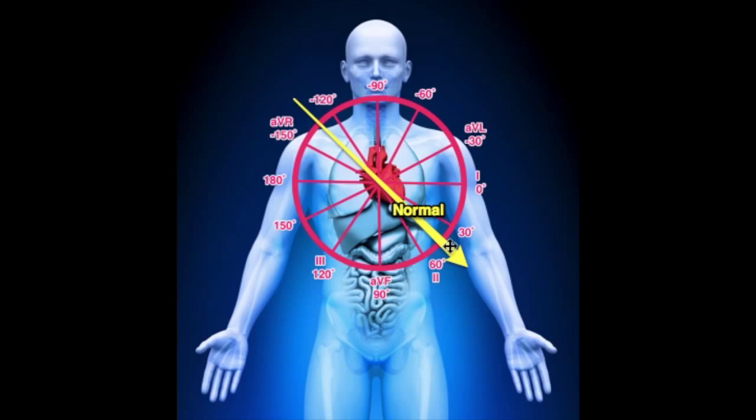So what are you going to see if you have a normal cardiac axis? Well, you're going to see that the lead that most resembles your axis, which is lead 2, is going to have a nice positive big wave deflection like that. That's why we say you always start with lead 2, because if you have a normal healthy heart, it's the lead where you'll see the most discernible P waves and the nicest, most positive deflection.